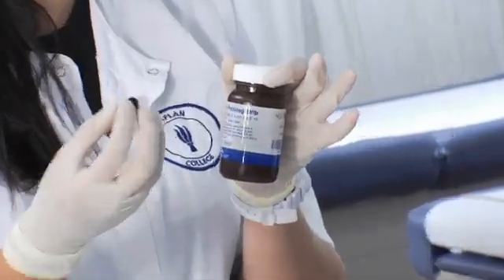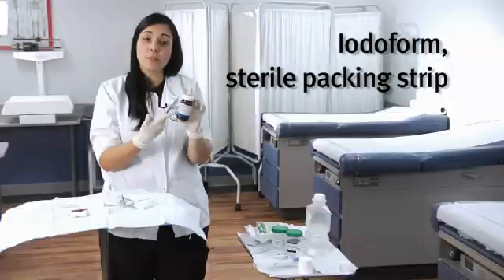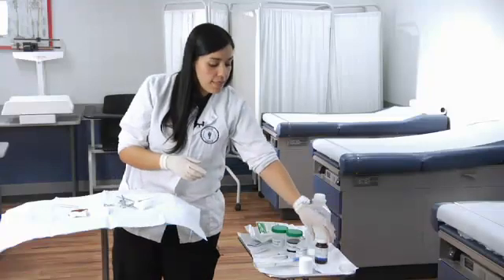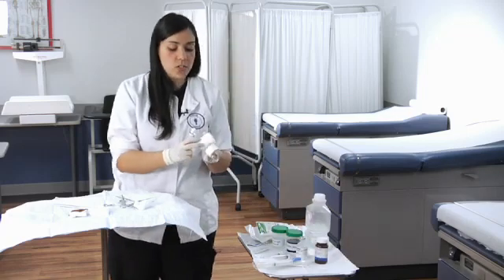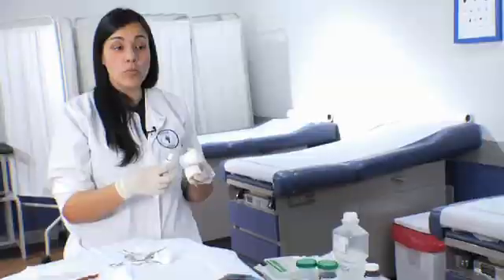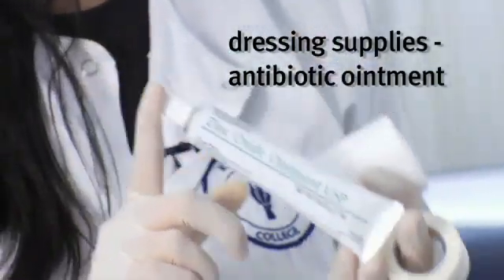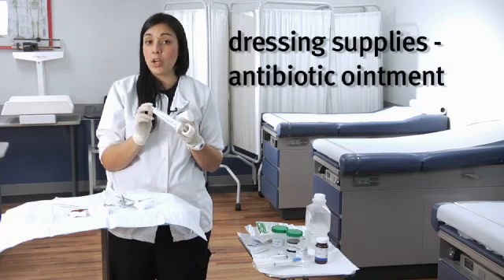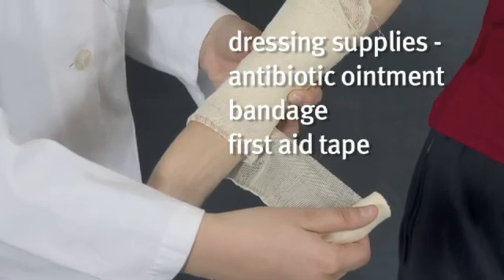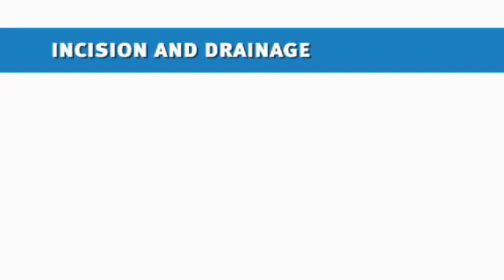Rather than leaving just an open hole, the doctor needs to pack it, which helps it heal from the inside out. The patient often has to come back a couple days after to remove and get a new pack inserted until it heals completely. Toward the end, once the procedure is done, you have some dressing supplies. The physician might ask you to dress the wound and provide follow-up care instructions. You have zinc oxide ointment here — though this depends on physician preference; sometimes they use bacitracin or another antibiotic ointment — and then your bandage dressing to keep the wound closed. And that's pretty much it for the incision and drainage tray.